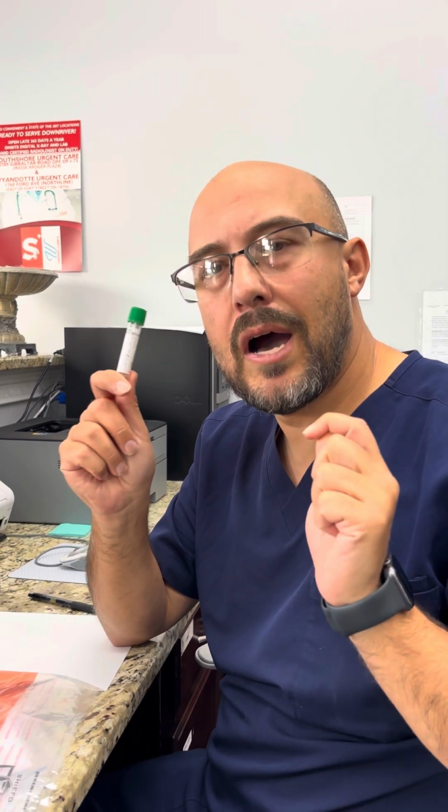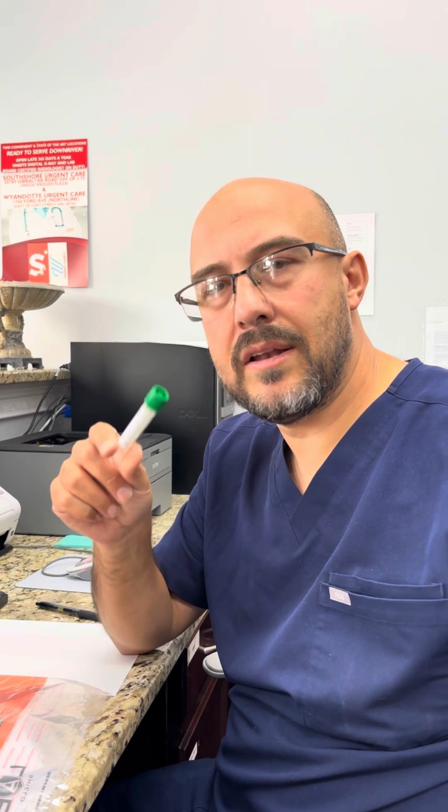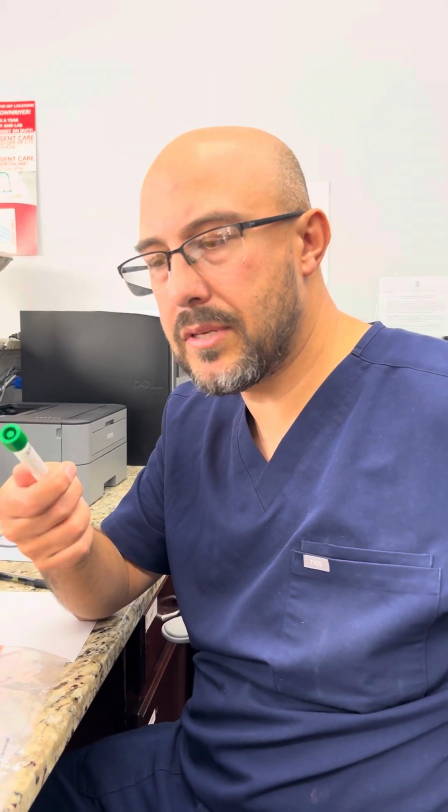And again, putting in this and the urine, it's the same exact process all throughout in the system. The only thing is picking the correct test. And if you're not sure how to pick the right test, then go ahead and ask. But again, pick COVID, pick flu A/B, pick RSV, pick whatever test that the provider wants. If you're not sure, ask, and I'm sure someone will be able to help you, or you can call me and that shouldn't be an issue. I'd be more than happy to assist you.